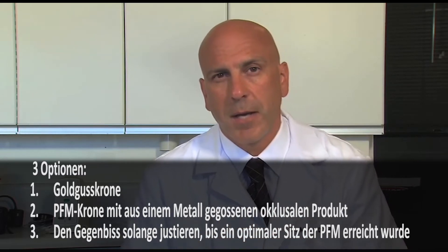Another reason why a Bruxer monolithic zirconia crown is such a good idea is that we see a lot of cases in the laboratory where dentists have had to underprepare for any number of reasons. In those cases, we have very few choices — typically a cast gold crown, a PFM crown with a metal occlusal, or adjusting the opposing teeth until the PFM fits. All three of those options aren't necessarily attractive to patients. Patients don't enjoy having opposing teeth ground down, and more and more patients are objecting to cast gold crowns, and patients aren't keen on a PFM crown with a big metal occlusal either.